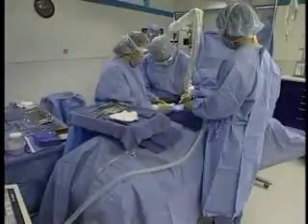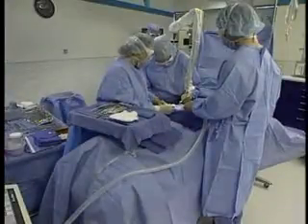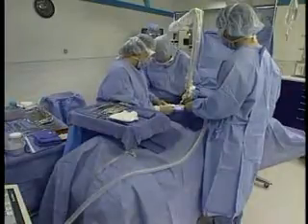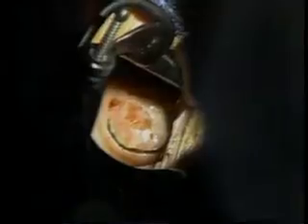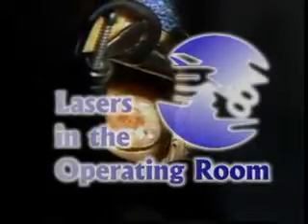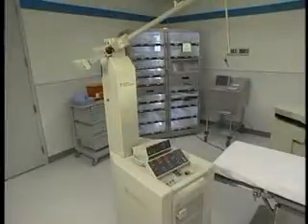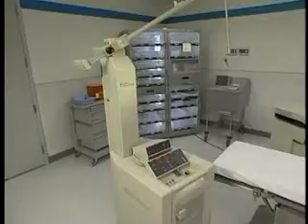The American National Standards Institute defines a healthcare laser system as an apparatus that includes the unit, delivery system, power supply with control and calibration functions, mechanical housing with interlocks, and the fluids and gases required for the operation of the laser. The application potentials are endless. Every surgical specialty has studied the various wavelengths and their applications to tissue.